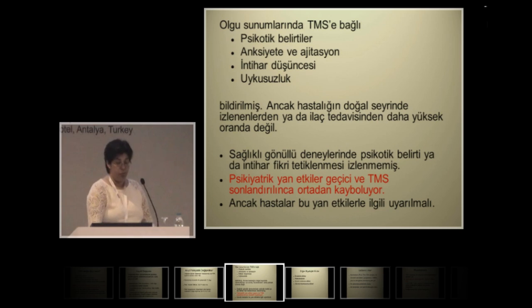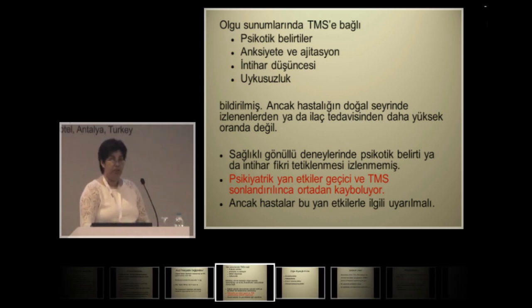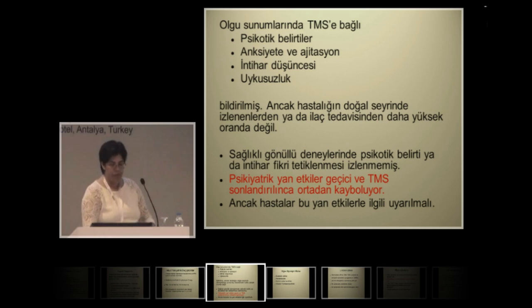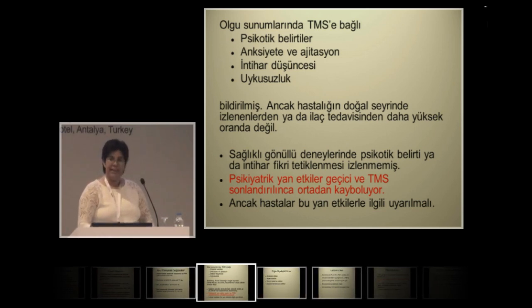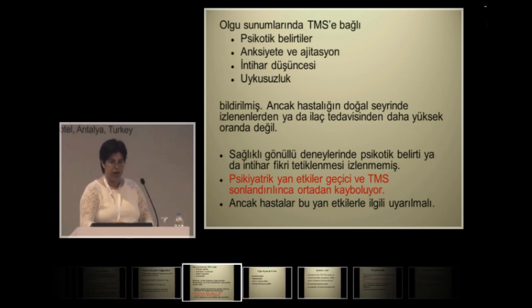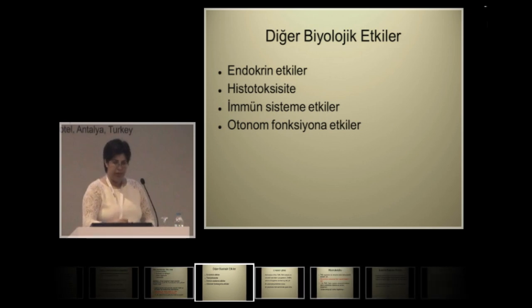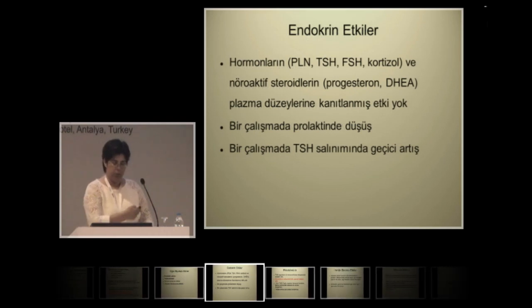Apart from those, sleep deprivation, suicidal ideation, anxiety, agitation, and psychotic symptoms have been reported, but they may be part of the natural course of the disease, and they are not higher as it is observed with medications. Psychotic symptoms or suicidal ideation has not been reported with healthy individuals, but such symptoms disappear when you stop the treatment. Other biological effects are not important, so I will just skip over them.